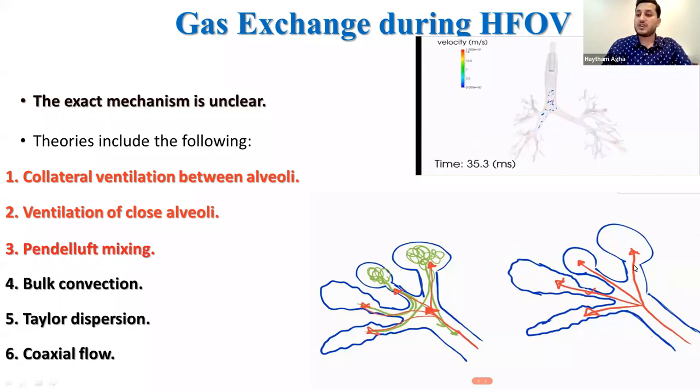If you look here at these alveoli, you will find different types of alveoli with different compliance. Here is a highly collapsed alveolus, and this is a highly distended alveolus. During conventional mechanical ventilation, the gas goes in and out in a laminar way. So this gas will be distributed equally over all these alveoli. If we give high tidal volume to expand these alveoli, the distended alveoli will rupture. If we give low tidal volume to save them, these alveoli will stay in the atelectasis zone. But in high frequency ventilation, because of turbulence of the gas in and out, during expiration not all gas comes out of the alveoli, but it diffuses from this alveolus to the adjacent alveoli. With repeated inspiration and expiration, all of these alveoli will become recruited at the same point and to the same degree with minimal tidal volume.